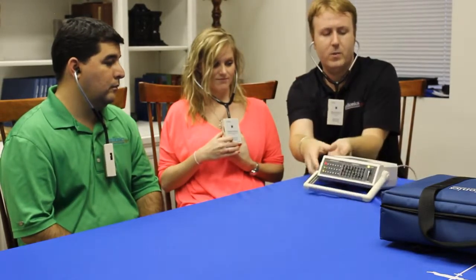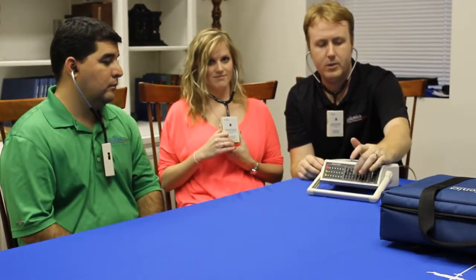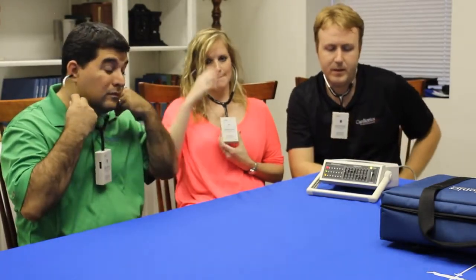Sounds are coming through. Another feature of this system is the ability to adjust the frequencies between heart and breath sounds. This makes it very unique and specific — something that high-level cardiology people really enjoy about the scope itself.